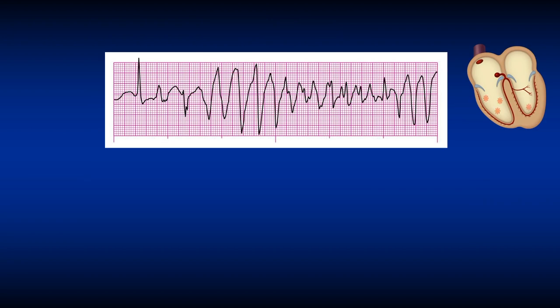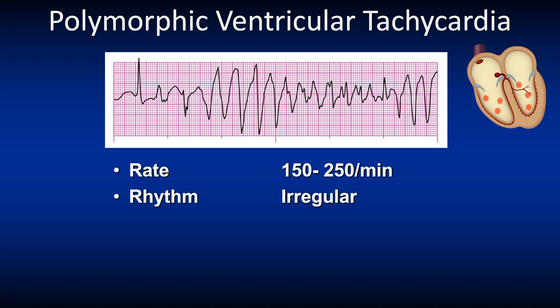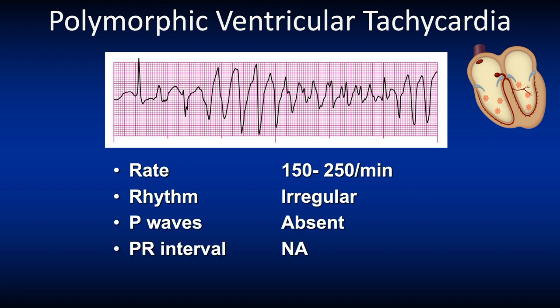This slide shows a polymorphic ventricular tachycardia. The rate is 150 to 250 per minute, the rhythm is irregular, P waves are absent, there is no PR interval, and the QRS complex is wide.